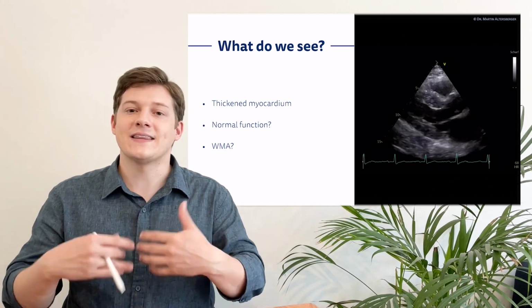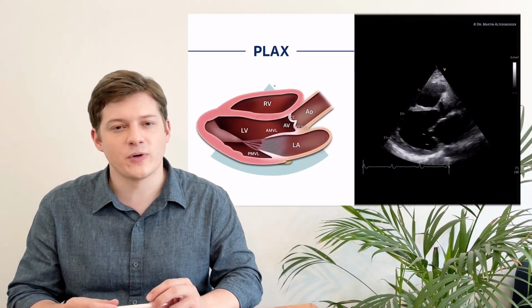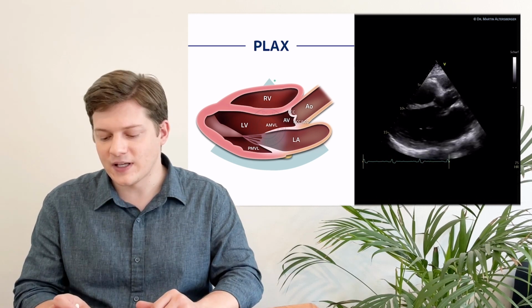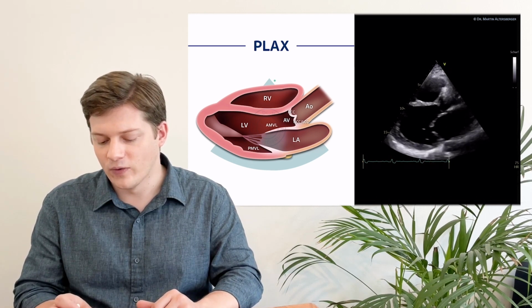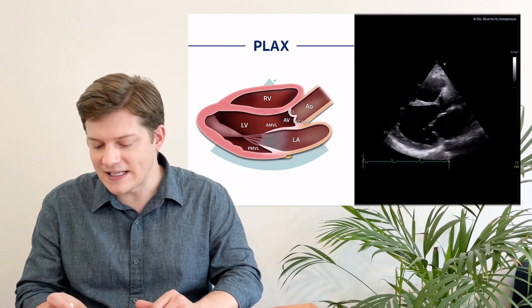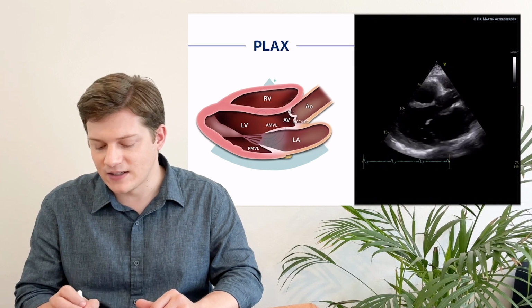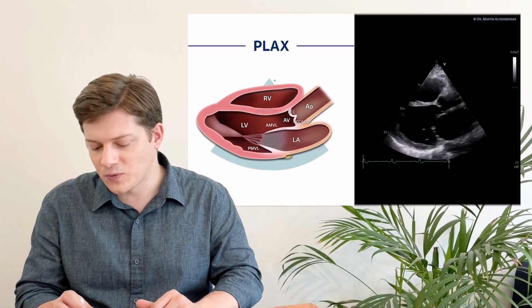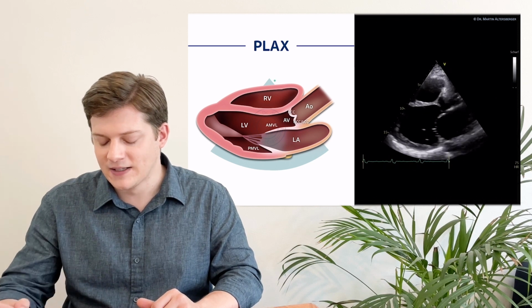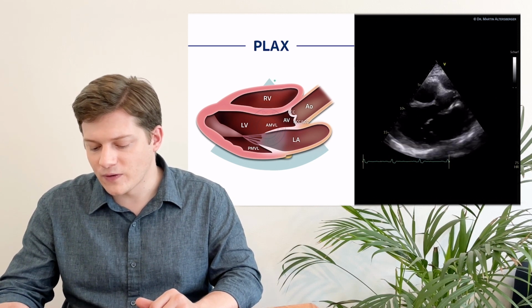Let's move on to another pathological example, and every one of you will already know that this cannot be normal. In this case, we have the interventricular septum over here. It's basically akinetic. It's very, very thin. It looks like a scar. We do have the posterolateral wall. It's a bit thicker. Left ventricular function seems to be impaired, and also focus on the valves.